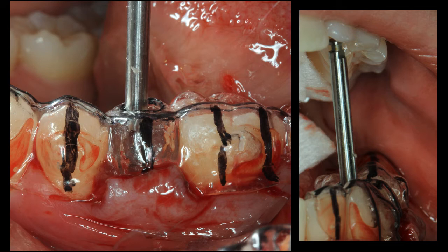Optimally, I would have chosen a fully guided surgical guide for dentists who did not place many implants. In this particular case, we performed sulcular incisions, reflected the buccal flap, inserted the surgical guide, and used the initial drill, which is the BTI initiator in this particular case.